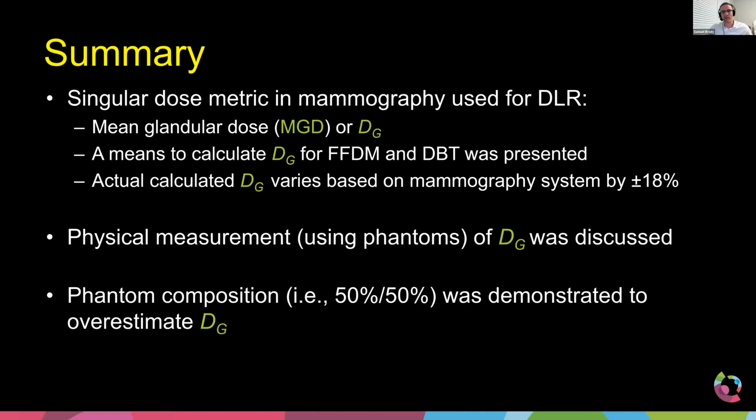We've talked about it from the very beginning that just simply turning down the dose is not an appropriate thing to do in radiology. The radiologists need to be able to make their diagnosis. And mammography, as we talked about last week, is particularly difficult. We're going to talk about dose optimization next. We're going to talk about all the tools and tricks we have to make the image better, the dose better, based on all the image stuff we talked about last week. So maybe the questions that we have here, you can answer after the next talk.